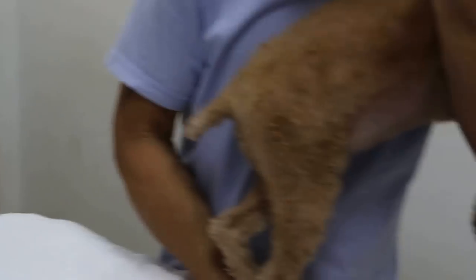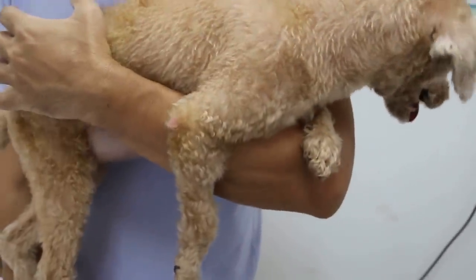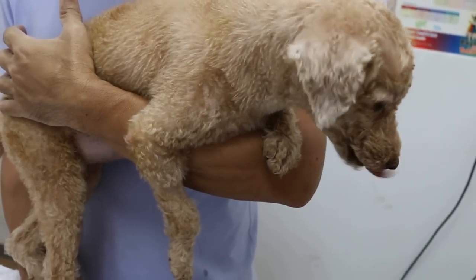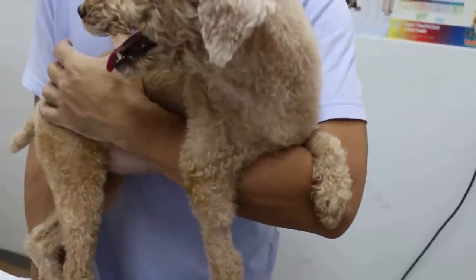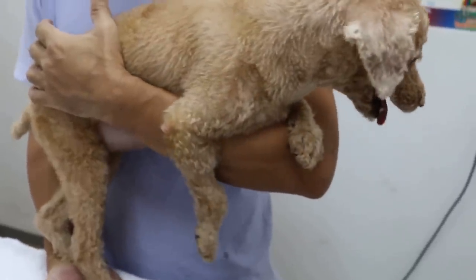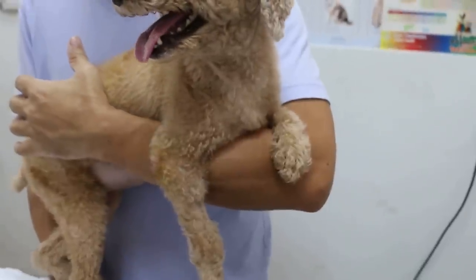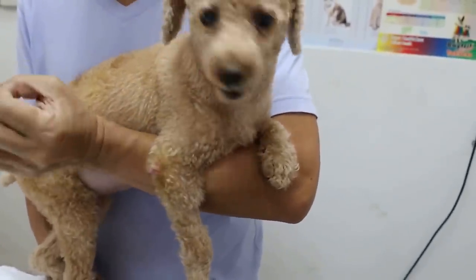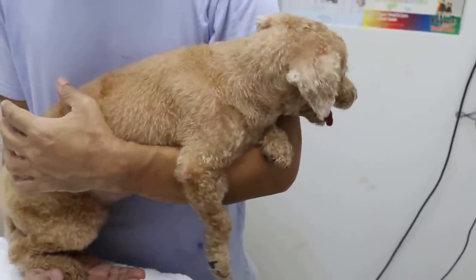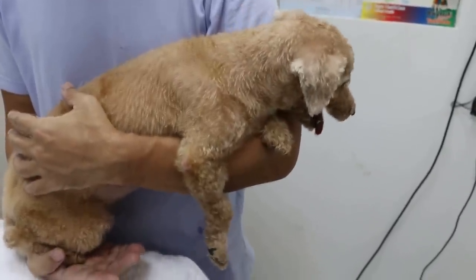The liver is big, but there are no discrete masses that I see. But both adrenal glands are big as well and have nodules in them. So I suspect the liver is enlarged secondary to the adrenal gland problem, like Cushing's. I don't see big tumors in the liver, it's just very big, just swollen. It can be big because of increased steroid production by the adrenal glands. That can cause the drinking to increase and urinating to increase.